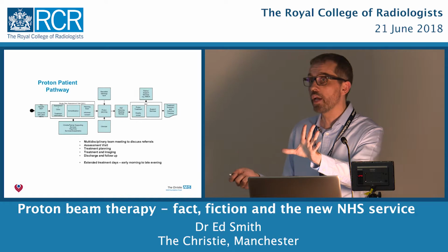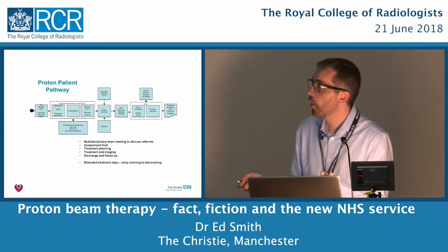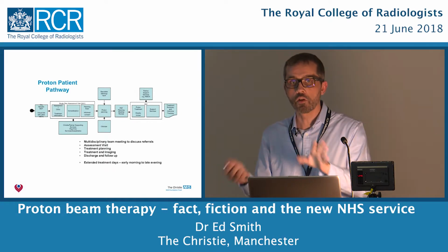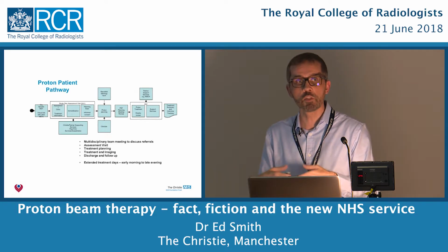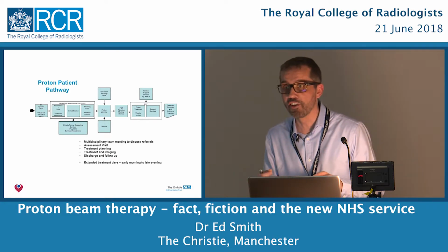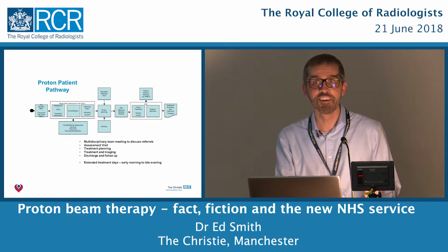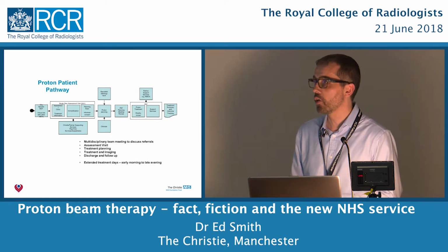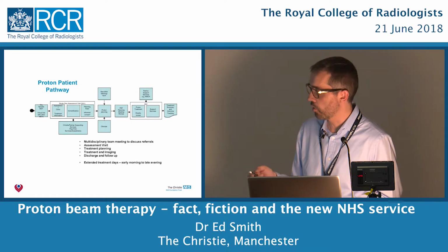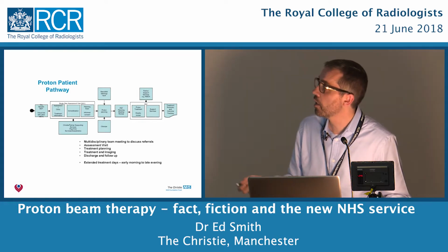The patient will then go away and we'll plan the treatment. And that process will take about 2 weeks. And we've been very careful to ensure that there is consistency across the service. We will have peer review meetings where we will peer review, i.e. colleagues will basically look at the plan I've done and tell me if I need to do changes. And I'll do the same. But we think that process is very important for these rare tumours and this new technology. And then that plan will be brought back to that meeting to actually see what the final plan looks like.